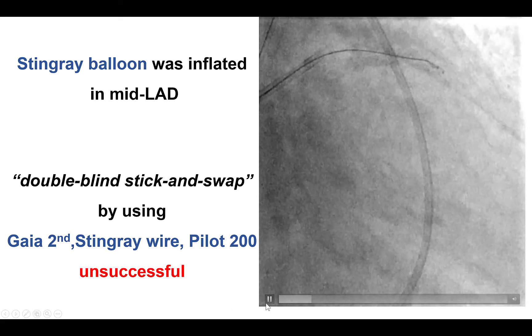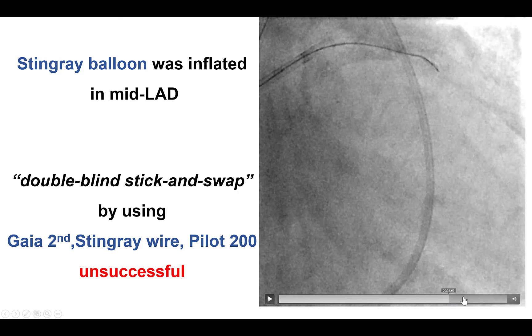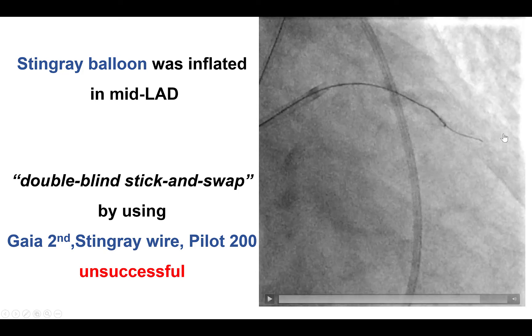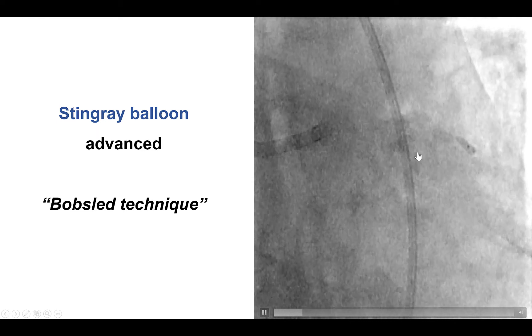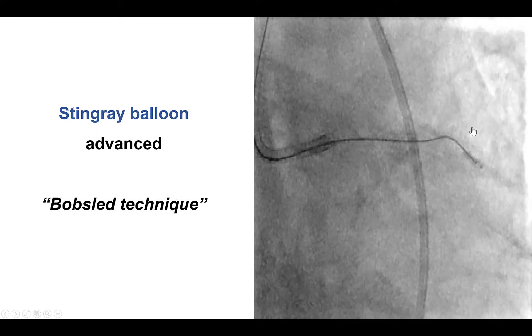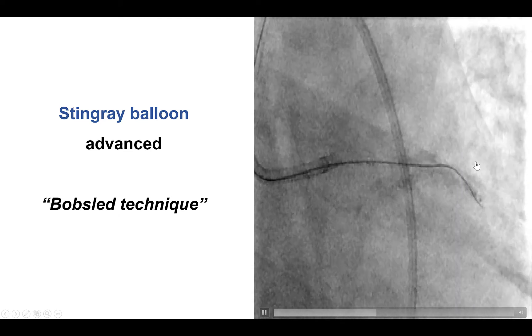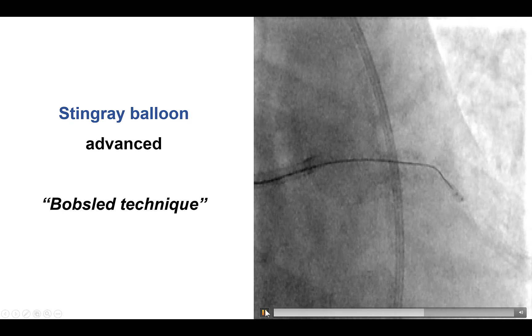Unfortunately, in this particular case, despite puncturing both ports and then using the Pilot 200, the Pilot 200 seemed to follow a course that was not consistent with the anticipated course of the left anterior descending artery. We therefore changed the re-entry zone using what is called the bobsled technique, which simply means that the Stingray balloon is advanced to a different location in the coronary artery.